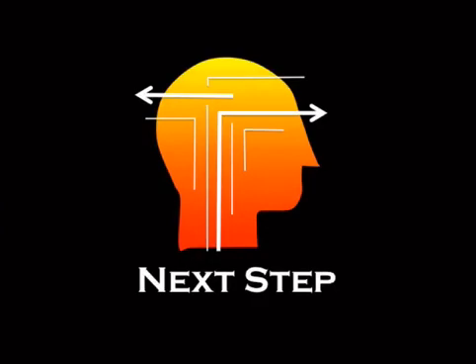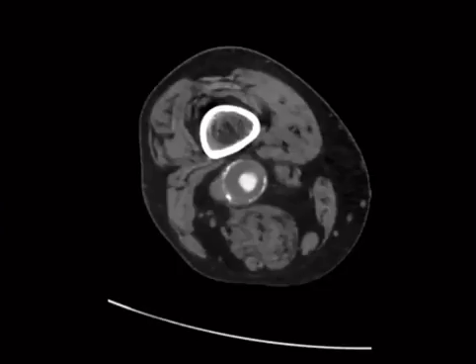So here's a next step question. Okay, so when you see this, what do you think of next? That's the question. So this is an aneurysm of the popliteal artery. If I was going to ask you, what do you want to do next? Do you want to look in their head? Do you want to look at their chest? Do you want to look at their other leg? Do you want to look at their belly? What would you say and why?